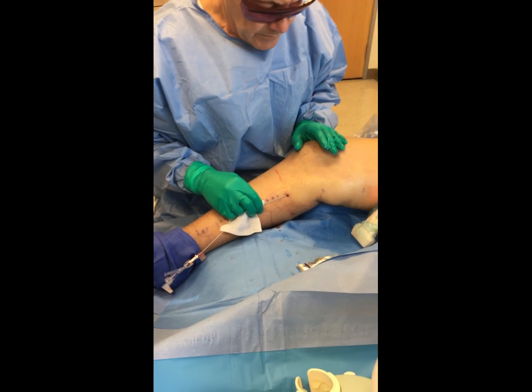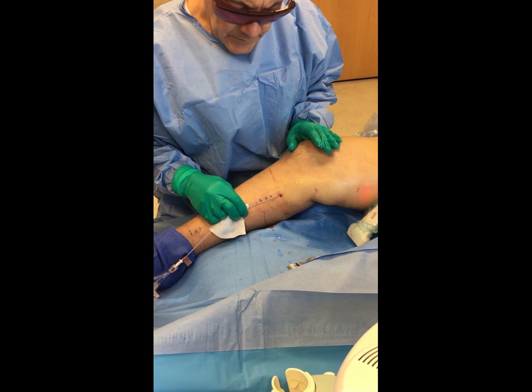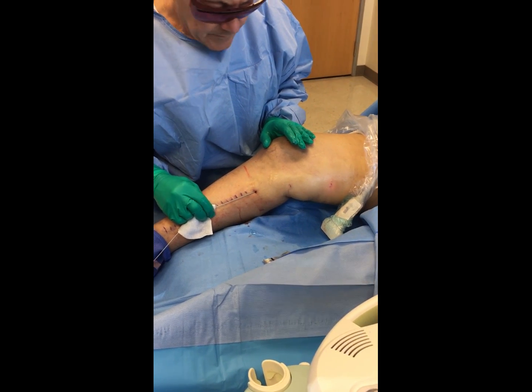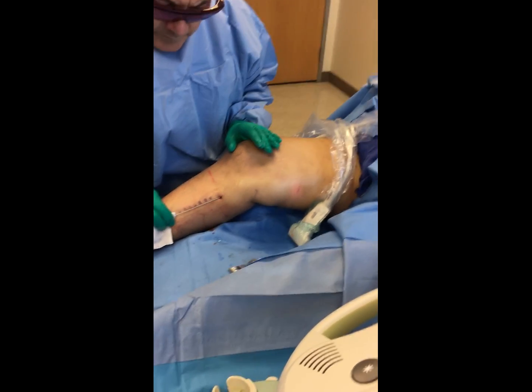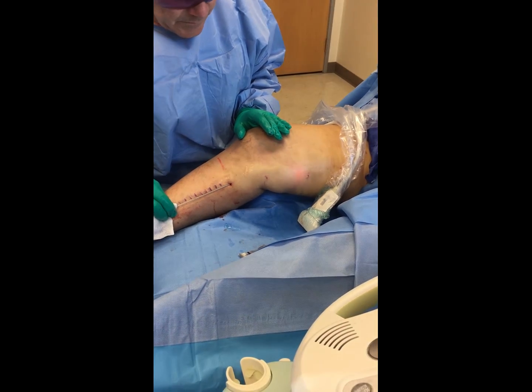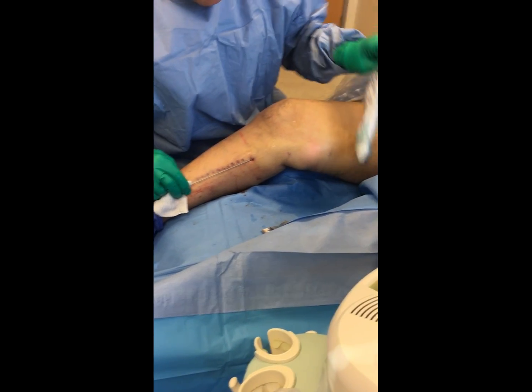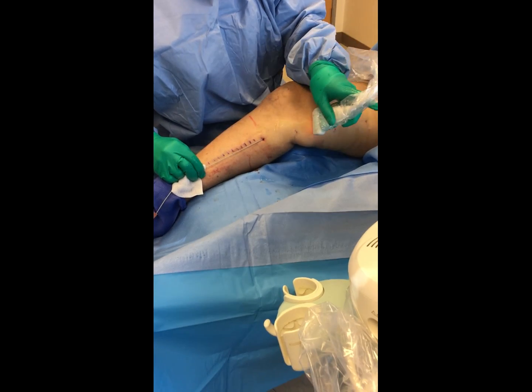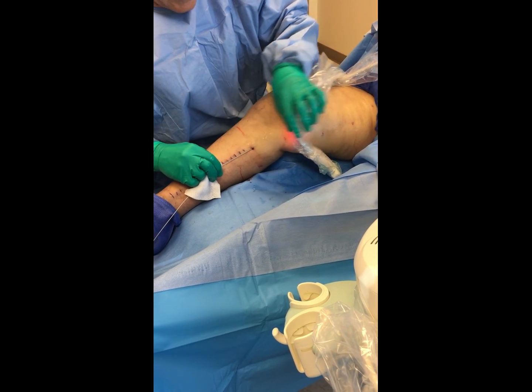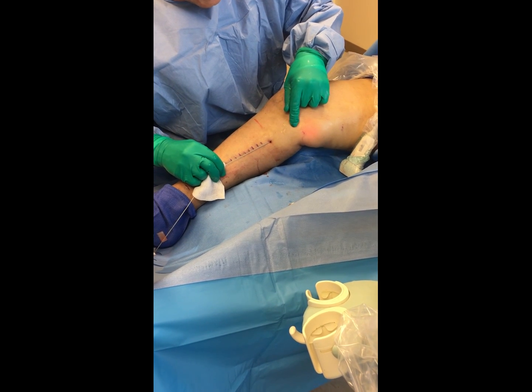At 25 joules per centimeter you can see where the laser is by the red dot right there. It takes very little energy to close this part of the vein since it's outside the compartment — which goes really fast. I call this the zipper. When she comes back it will be all closed up.